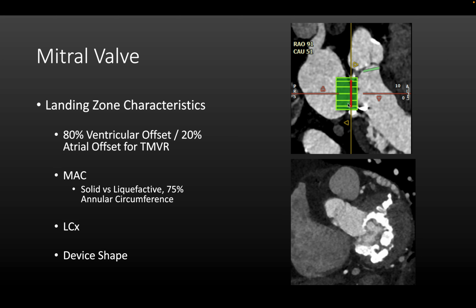This view is a 3-chamber. We could see that this is the left atrium, this is the left ventricle, outflow tract, aortic valve, and that is the aorta. So whether this new valve will obstruct the outflow tract? Will it obstruct the blood coming out from the left ventricle to the aorta or not? And we could describe what is the offset. For example, please put it more at the atrial level than the ventricular level and so on.